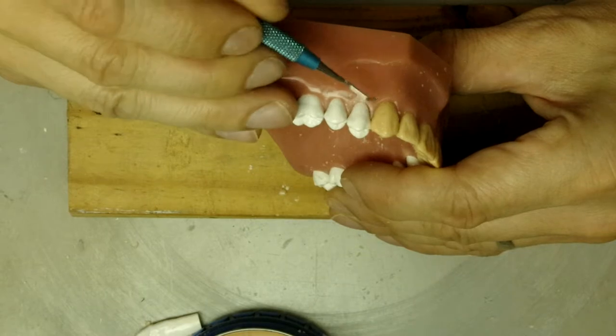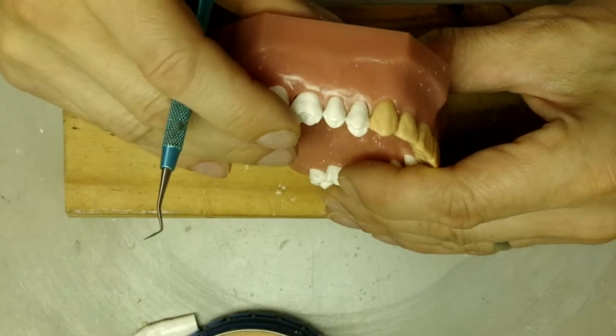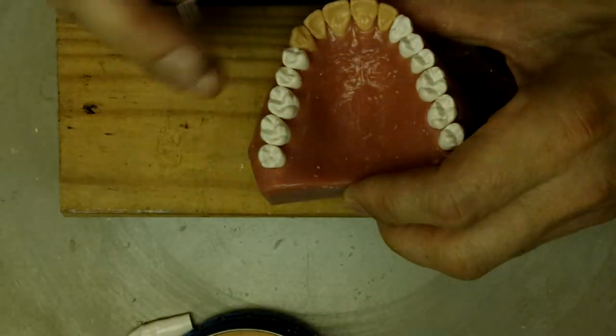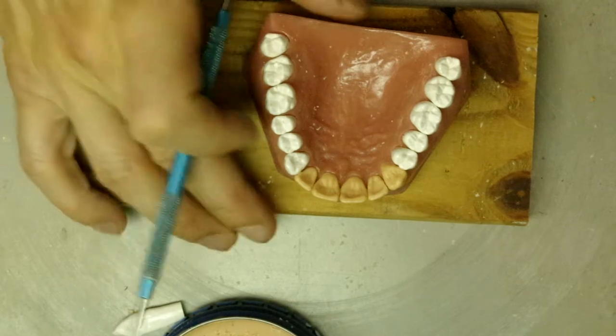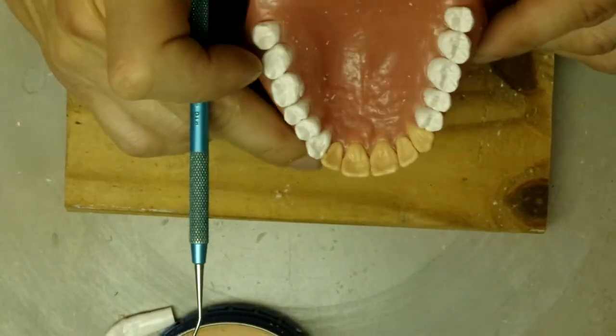And we'll clean it out. And there we are — that's our right canine, tooth number six.